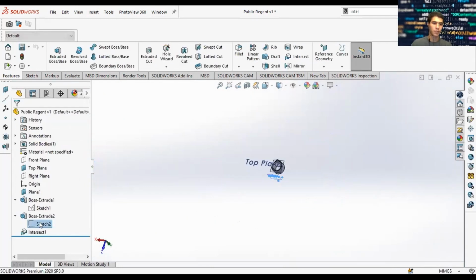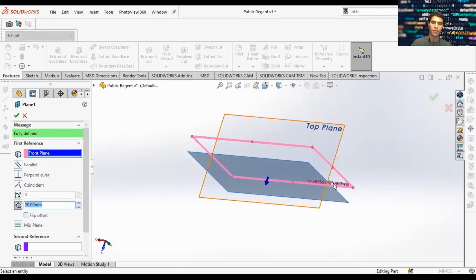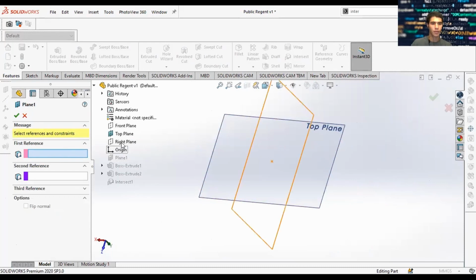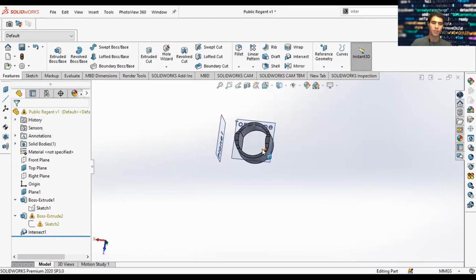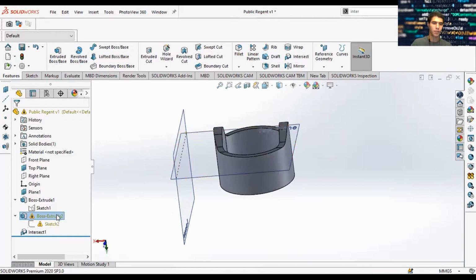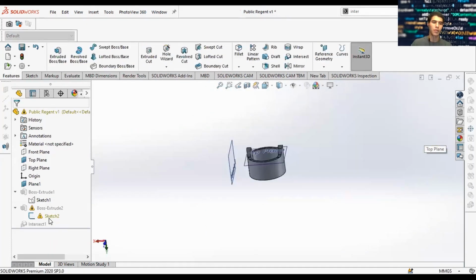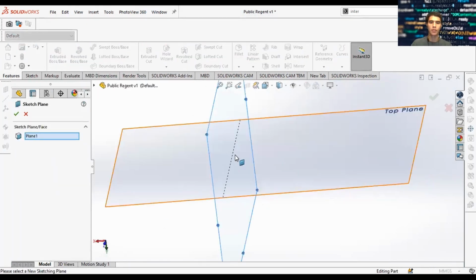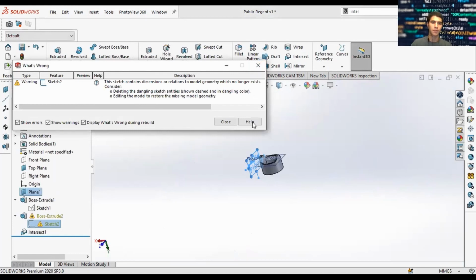Right now it's plane 1. This is the right plane. We're going to end this feature. And then we select extrude through all, and this sketch is asking, where is my plane? So I need to give this sketch a new plane, edit sketch plane. In this case, we selected plane 1. Let's remove it.